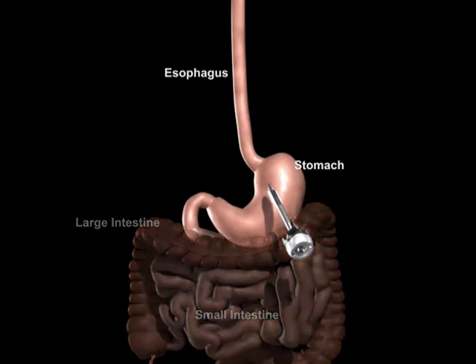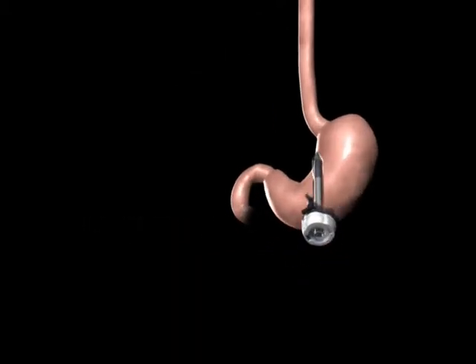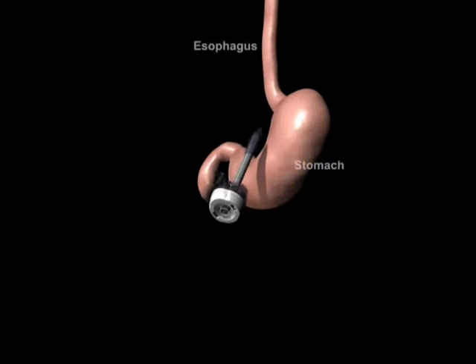The surgeon examines the abdominal cavity using a laparoscope or video camera. In preparation for the band, a tunnel is created behind the stomach. The Realize Band is then introduced to the abdomen through a trocar.